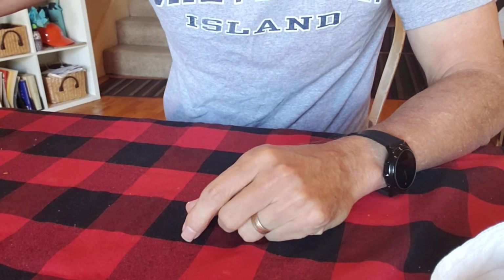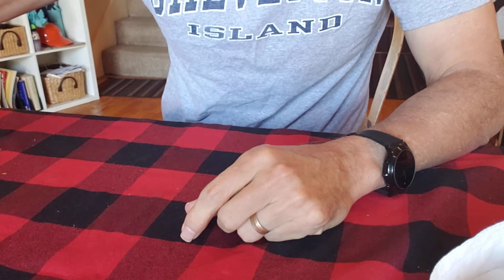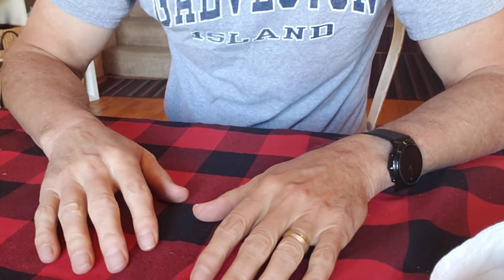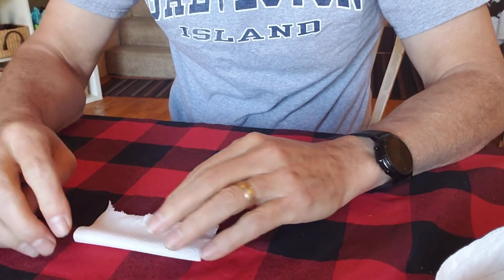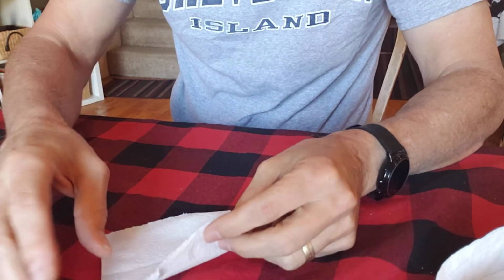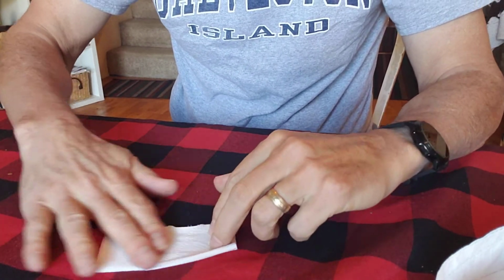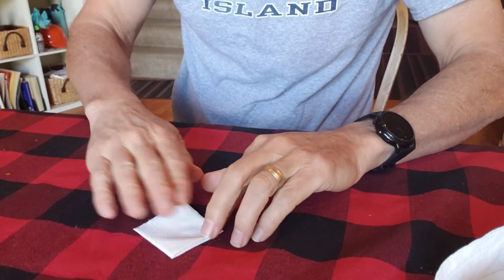Alright, I wanted to show you a toilet paper hack that I've used to decrease the nose leakage on my face masks. The short answer is that I take a square of toilet paper. It's 2-ply toilet paper, kind of soft. I fold it in half twice, so it ends up a quarter of the size of a square of toilet paper.